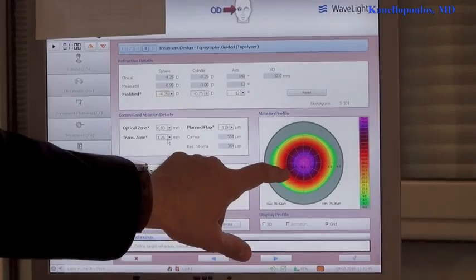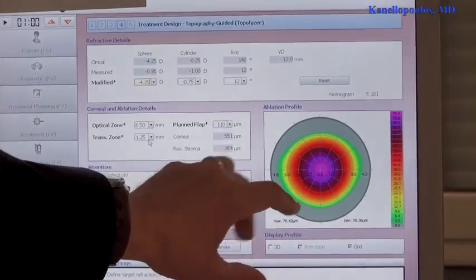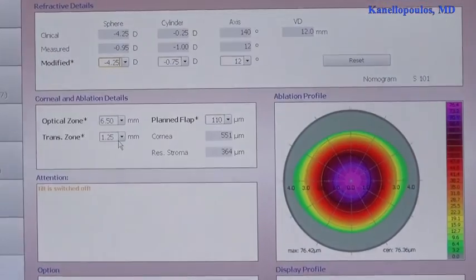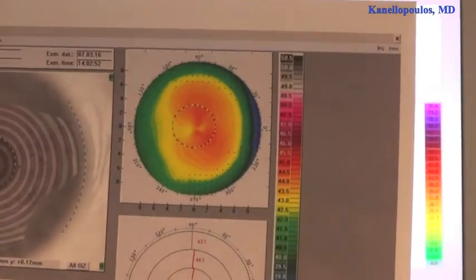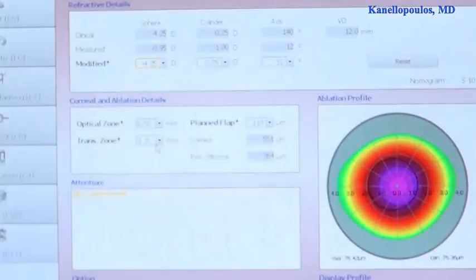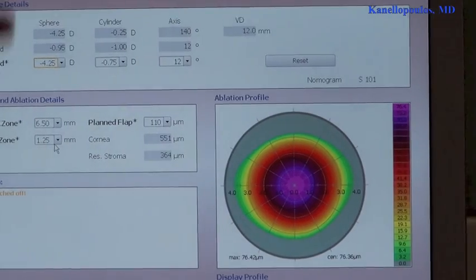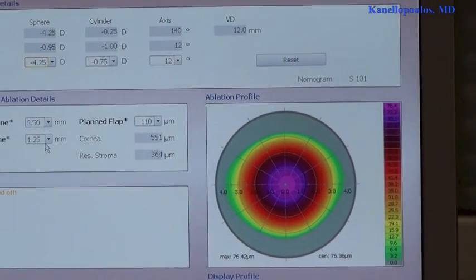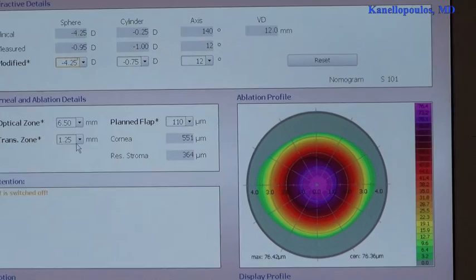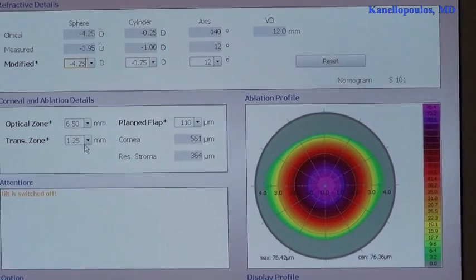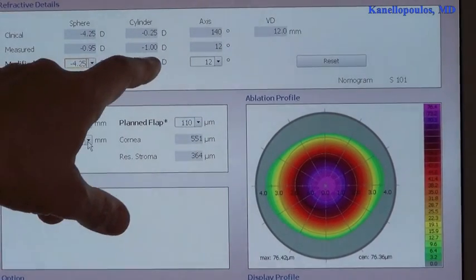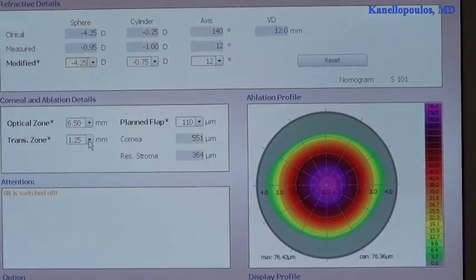So, this is the final treatment. Please note here that, in reference to the pupil, the ablation is slightly decentered because this addresses the angle kappa for that patient. And, we will treat this topography-guided. And, also, topography determined amount of cylinder and axis.